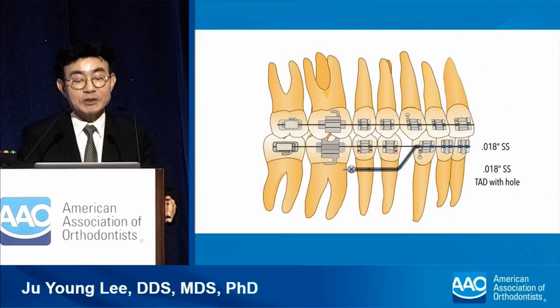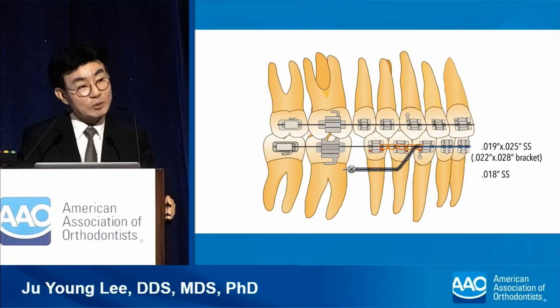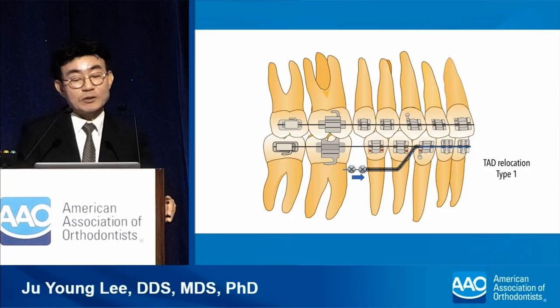As the 6 anterior teeth moved anteriorly by the open coil spring, class 1 canine relationship was restored, and the midline was also coincided. After preparing anchorage with an open coil spring to prevent the canines from retracting back, the premolars were protracted with elastomeric power chain. The protraction of premolars and molars slides along the main arch wire, which is usually 0.019 by 0.025 stainless steel rectangular wire. The next step is the protraction of the molars.